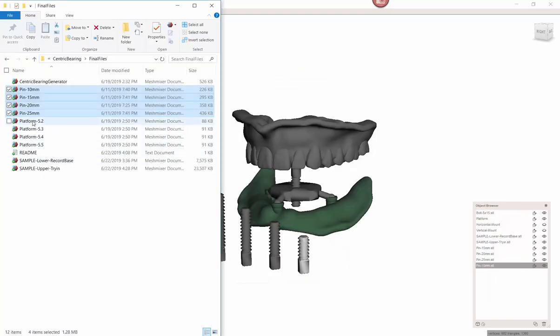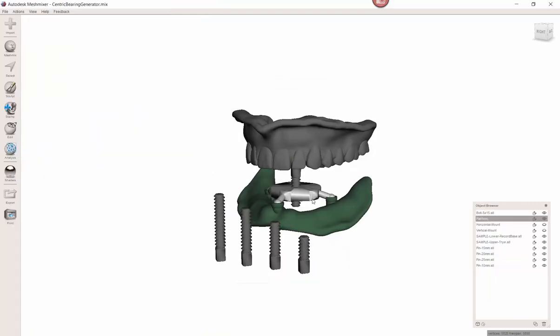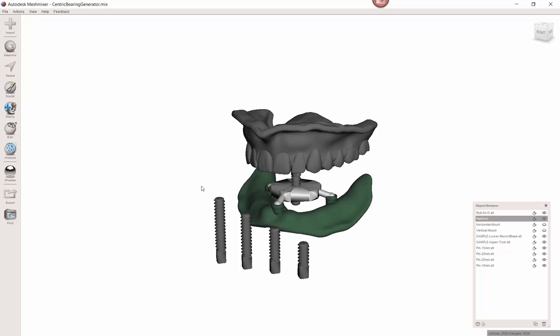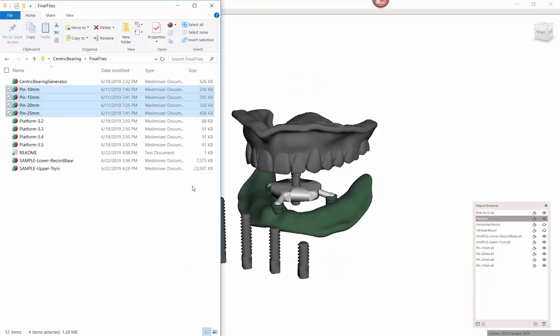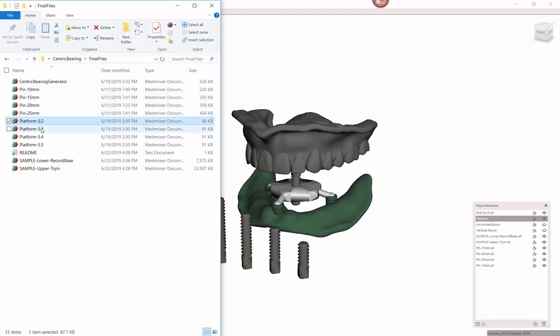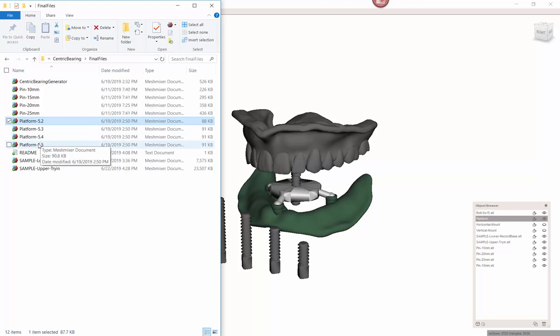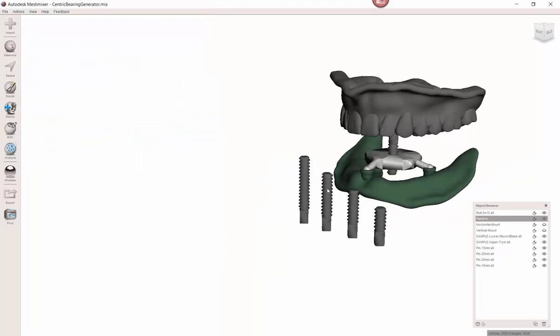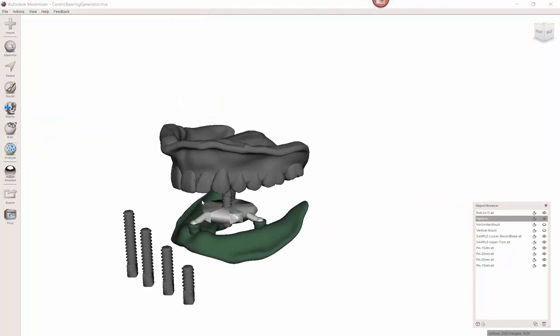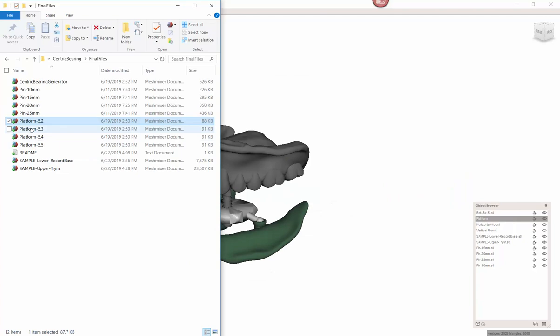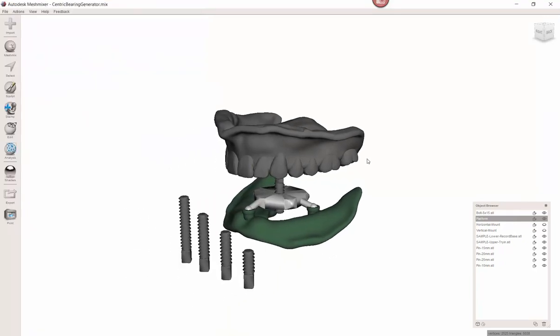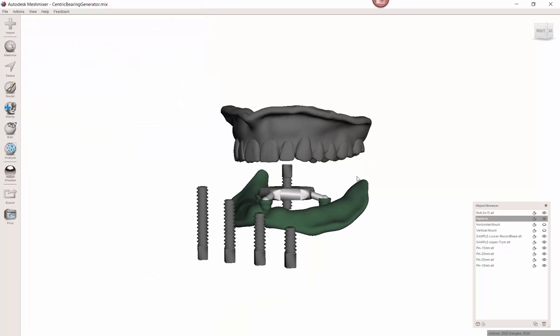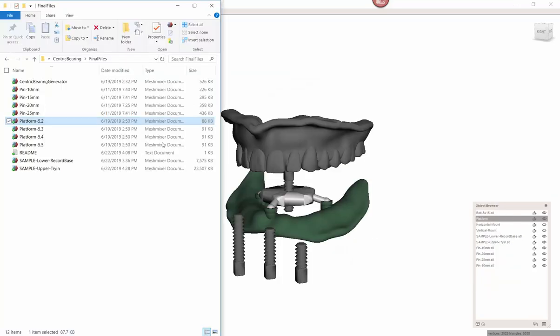As you see, if I bring this up and down, it will snap right into these little holes. It will nestle right in there. So you take that out first. You take your custom impression. You snap. Then you take this object. You just snap it right in there. And now you can also insert your bolt. And you're able to screw this up and down until you have the right bite. But that leaves out one step. We now have everything in the lower. But what about the upper? This strike plate I brought in here because I wanted to have sort of a basic place to start with. Now it might vary from case to case. But what I would do is I would now take the upper. And I'm going to move it around. And try to line it up with this. Now I need to move the upper up a ways. Get this somewhat right in the middle of the teeth. So you have this nice big platform for that screw to kind of slide around on. Can probably even go a little bit further down there. Hit okay.